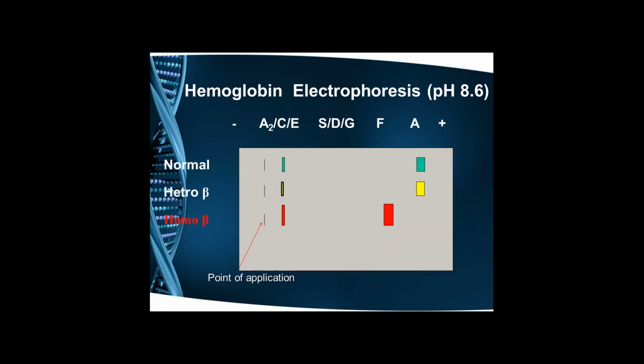Next slide, sir. So a difference here, when we have a look at it, gives us a very fair idea of what we are dealing with. This is just a schematic presentation of the Hb electrophoresis, which many of us would be using, and those who are using it would know that, yes, we can get a fair idea about the types of hemoglobin that are present, but quantifying it sometimes is difficult if we don't have a really good software and a scanner.